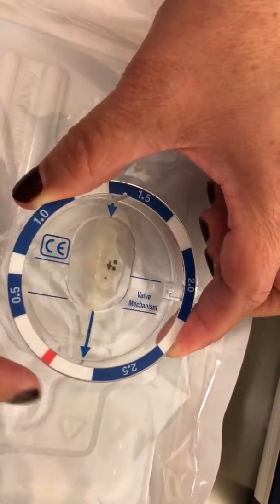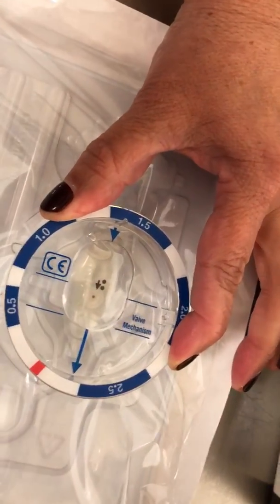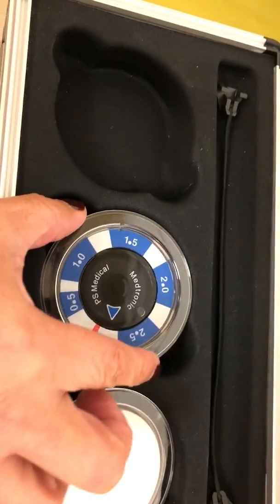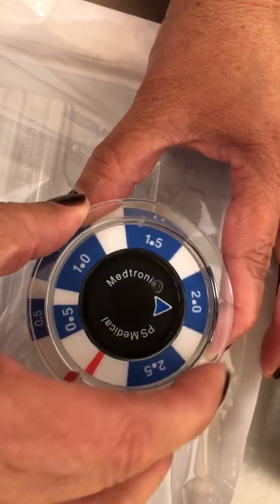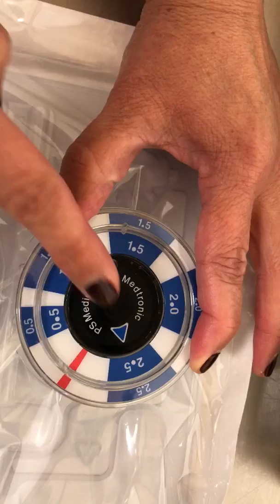You place it down, you hold it in place, you take step number two and you align the red to the red — red to red. And it tells you that it's currently set at 2.5.